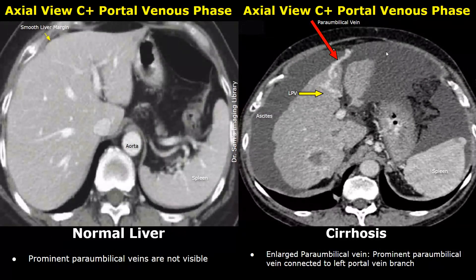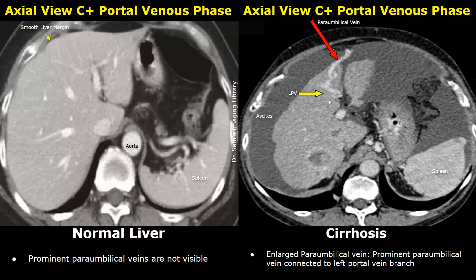An enlarged paraumbilical vein can also be present in cases of cirrhosis. The normal paraumbilical veins are not really visible on a CT scan, but when enlarged they appear as prominent vessels anterior to the liver, somewhat near the umbilicus. In this image, the paraumbilical vein is seen connected to the left portal vein branch. The liver has irregular margins, a reduced size, and there is presence of ascites.